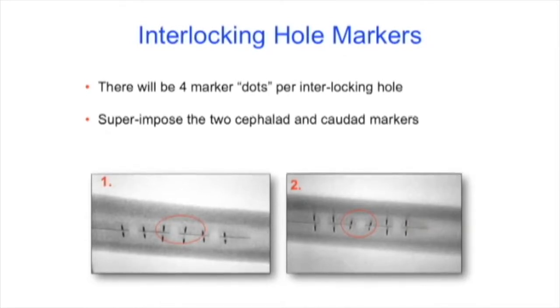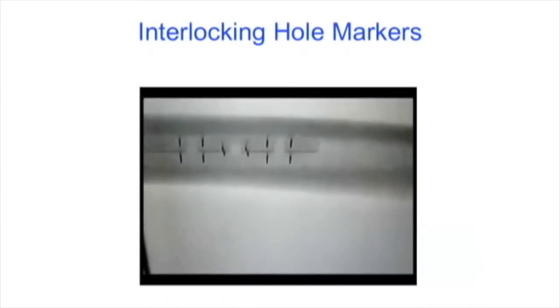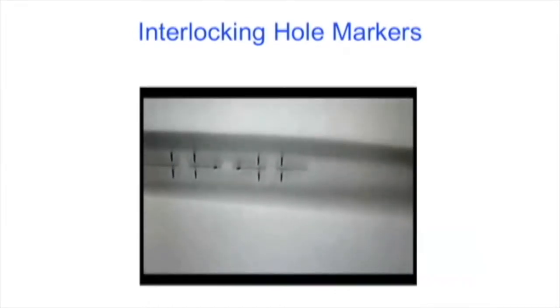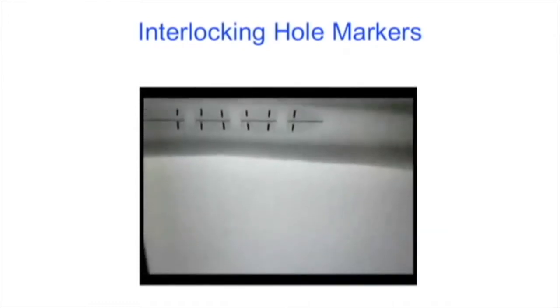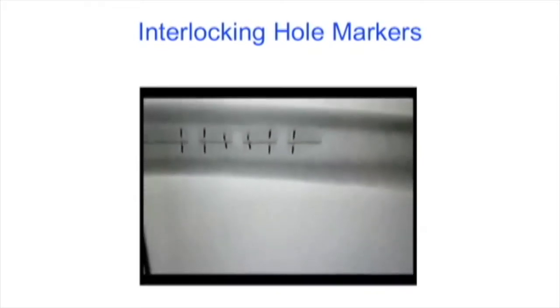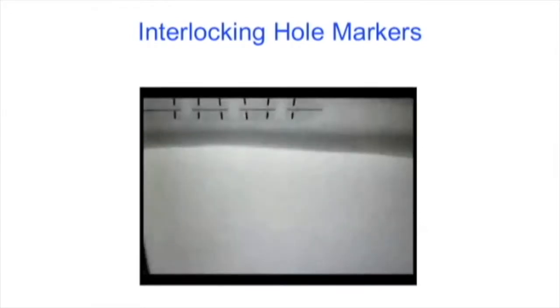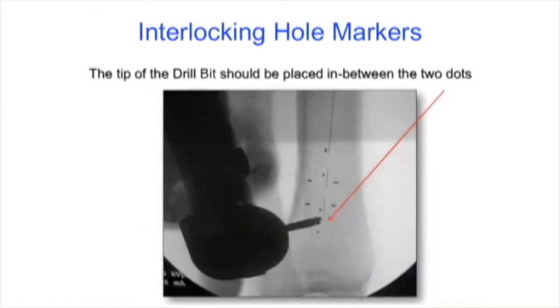But once you get those two lined up, it actually is facilitated fairly easily. So the way it works is after you line it up, you then put your drill bit right along the center of the hole, and you can actually even see what the outline is of the screw hole there. And sometimes you can even see that if you manipulate the KVP and the MA along the fluoro, but you can actually line it up pretty well, and you can put a drill bit in there, and it fires in fairly easily. So all you need to do is after you get the proper fluoroscopic markings, you then put your drill bit there dead center, you fire away, and it's pretty much like putting in a standard perfect circles technique.